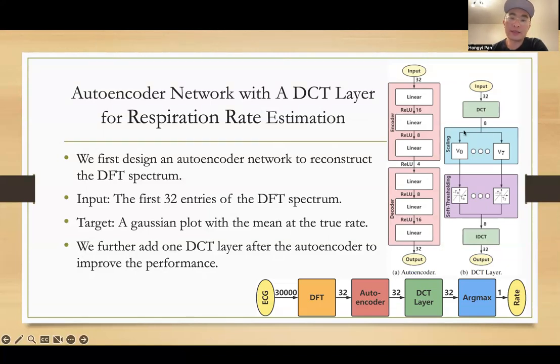Then we apply element-wise scaling, which applies weights on the DCT coefficients. After that, we apply soft thresholding on these DCT coefficients to remove the small noise in the frequency domain. And after that, we apply the inverse DCT to convert the signal back.